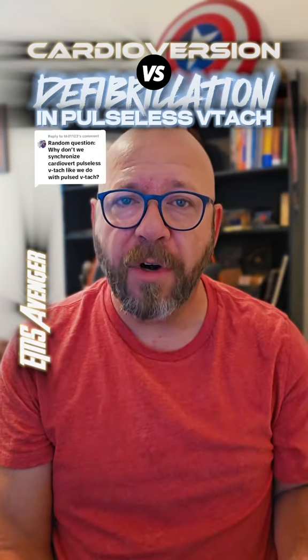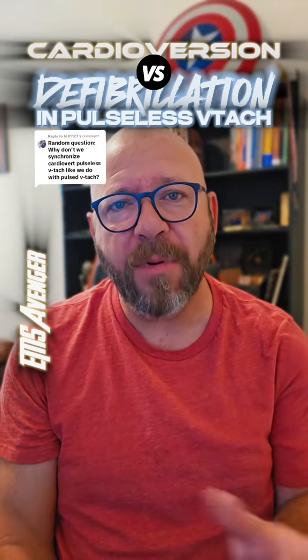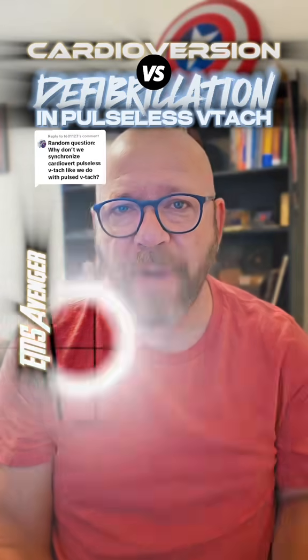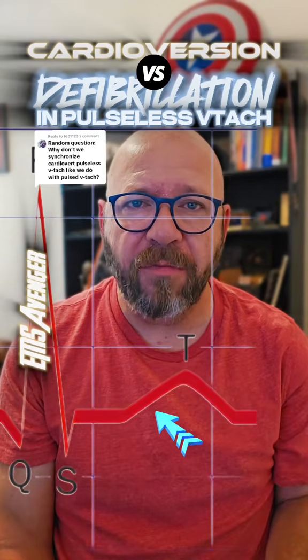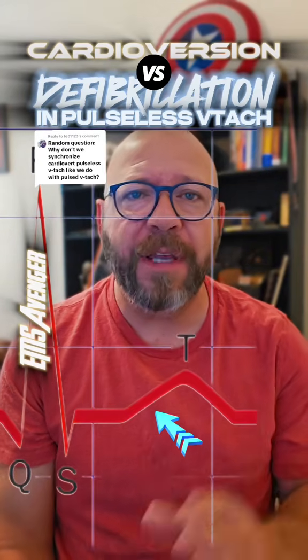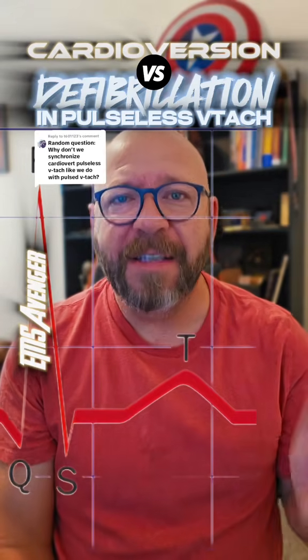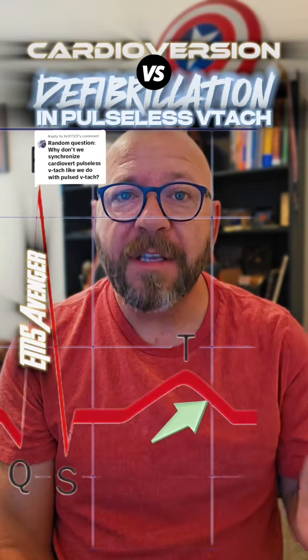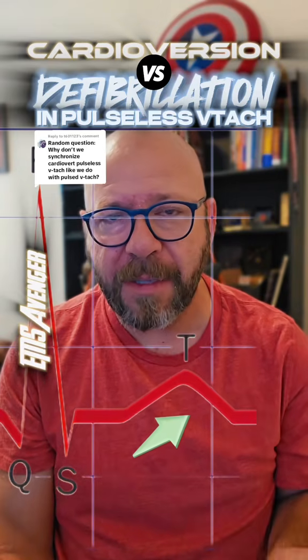we don't cardiovert while the myocytes are repolarizing. And we can see that repolarization with the T wave on the ECG. That upslope of the T wave is the absolute refractory period. It doesn't matter if we cardiovert there, the myocytes cannot respond to that. But the downslope of the T wave is the relative refractory period, and the myocytes can respond to stimulation then.